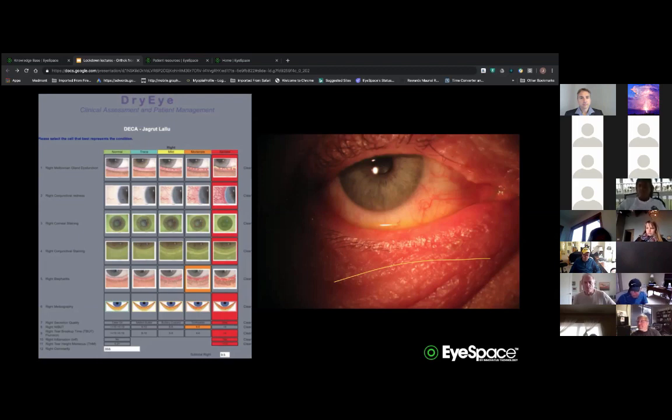If I've got a mild to moderate dry eye, usually I will start the fit within about 2 weeks of active treatment. Active treatment may include things like compresses at home, washes, oral medication, topical medication, and then obviously drops tailored more towards their dry eye. If you look on the left-hand side of the slide, that's a new tool we've developed.